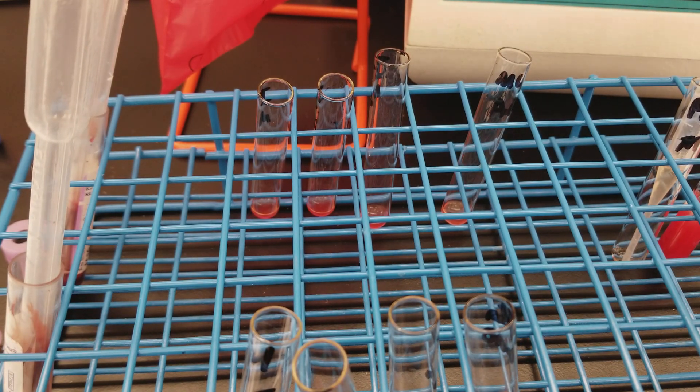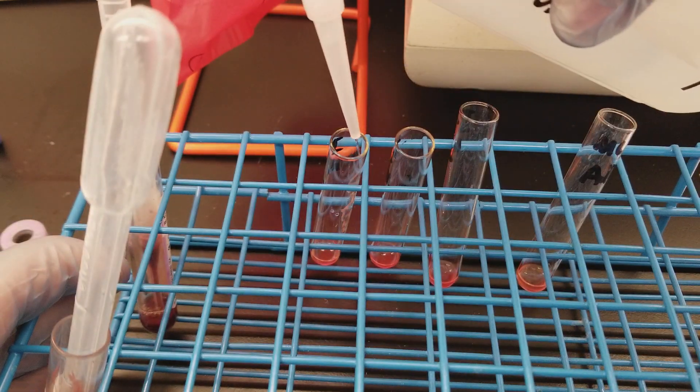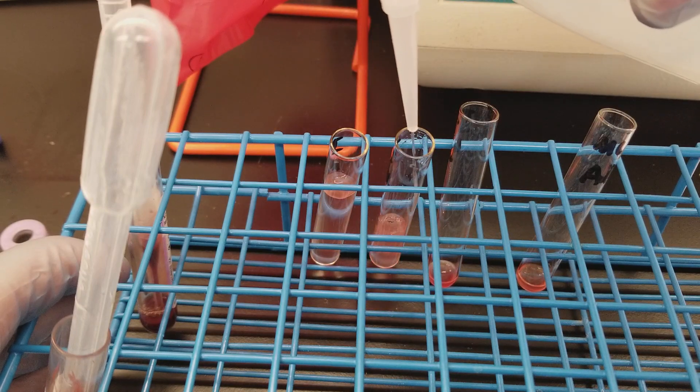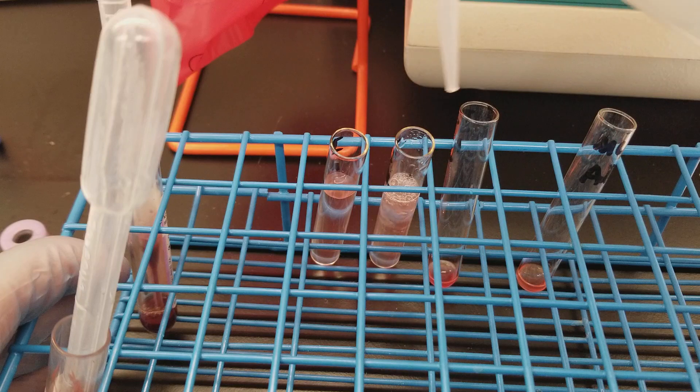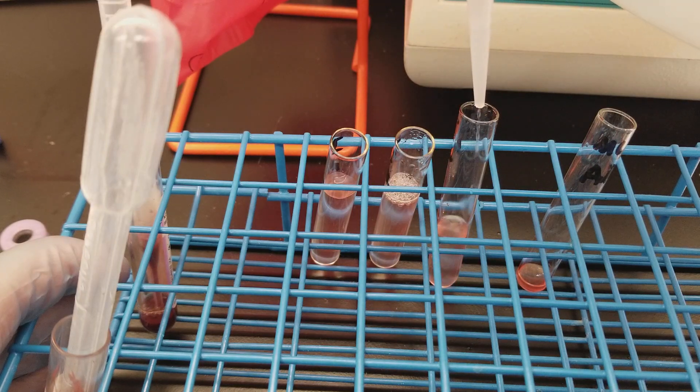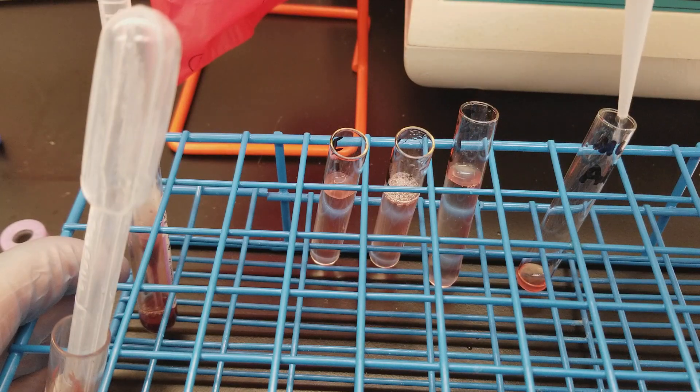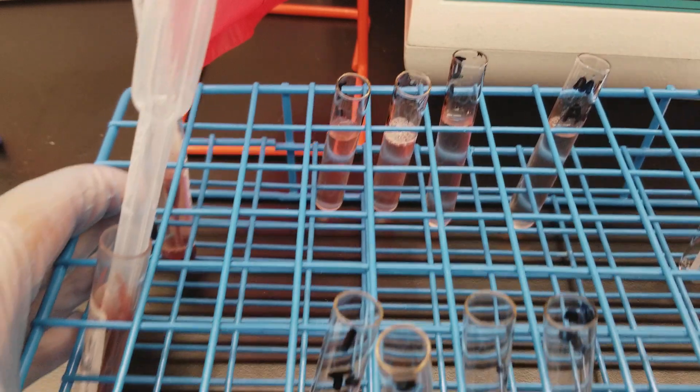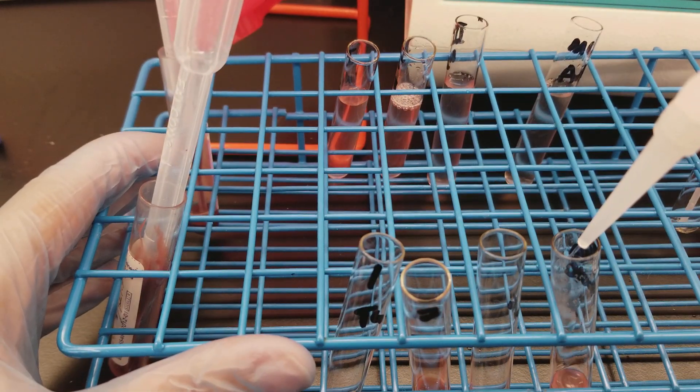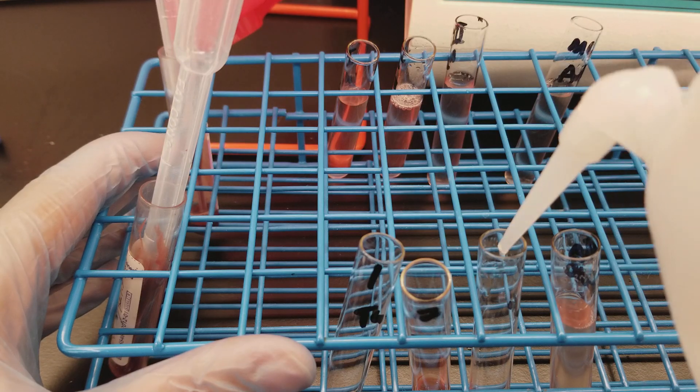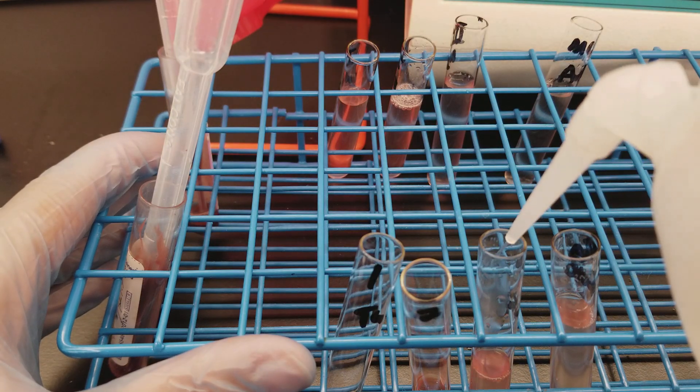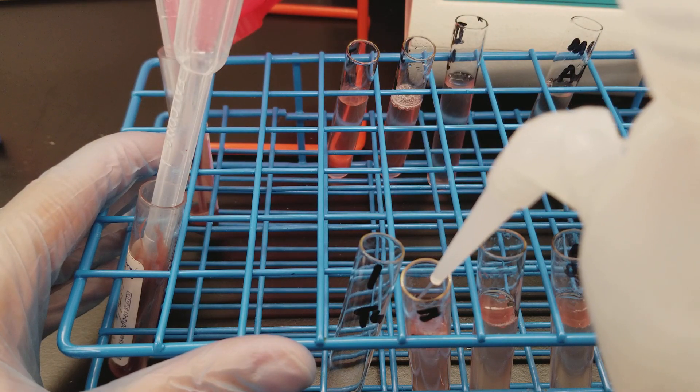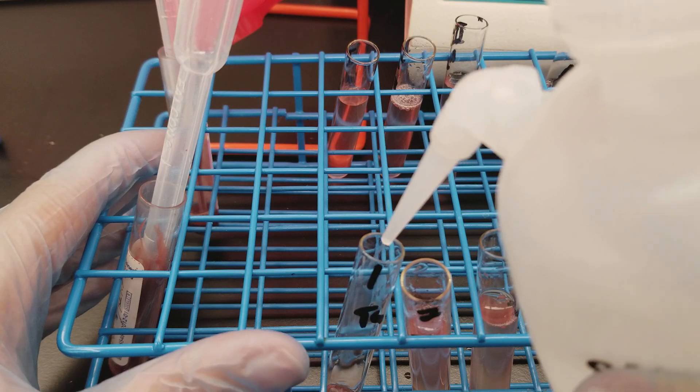So with the wash step, I'm going to add saline three quarters of the way up on each tube and gently re-suspend them. Spin them for 15 seconds. We won't read for agglutination until after we do this process three to four times. So we will wash them by putting saline three quarters of the way up the tube.